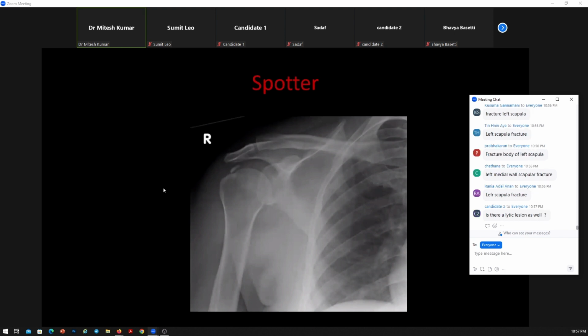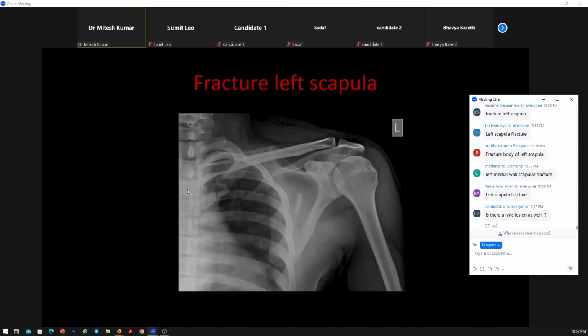No, there is no lytic lesion. Someone is asking, where is the lytic lesion? No, there is no lytic lesion.